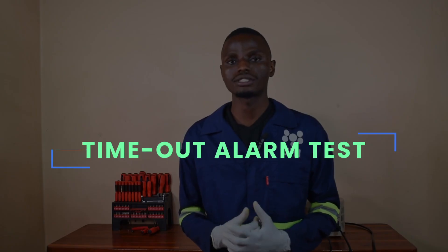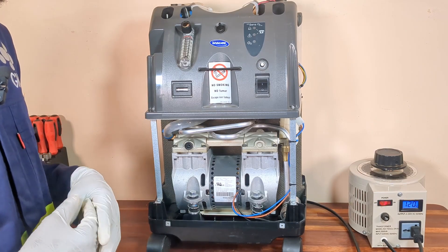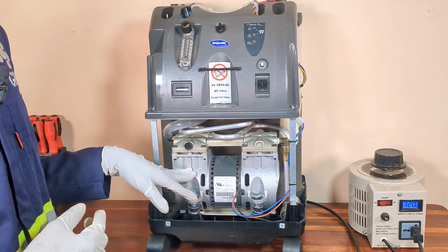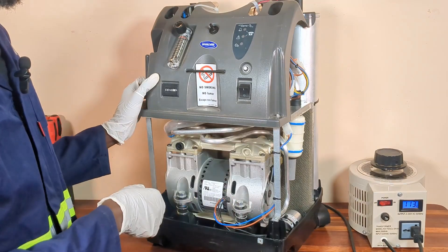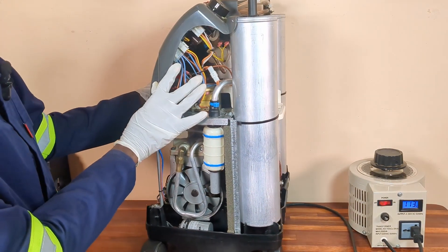Another test that you can perform is the time-out alarm test. The time-out alarm is designed to alert the user if the oxygen concentrator is not producing at least 85 percent oxygen concentration within five minutes after switching it on. To verify the functionality of the time-out alarm, you can isolate the air compressor from the system. To do that, I will disconnect the power cable supplying power to the compressor.